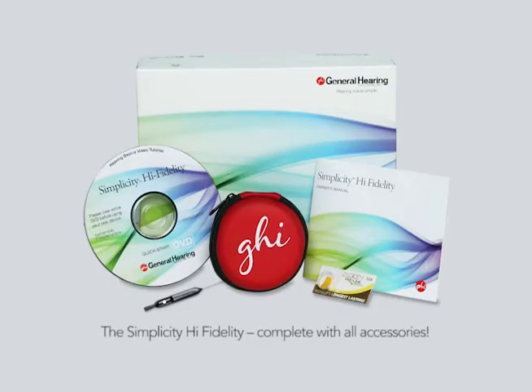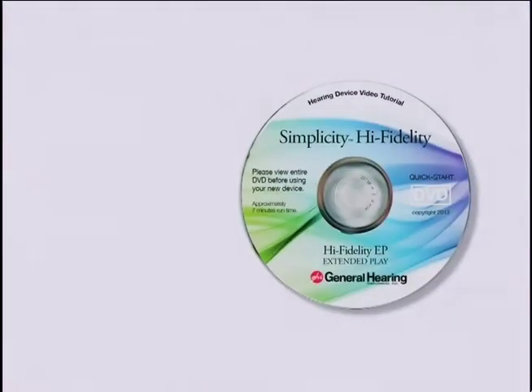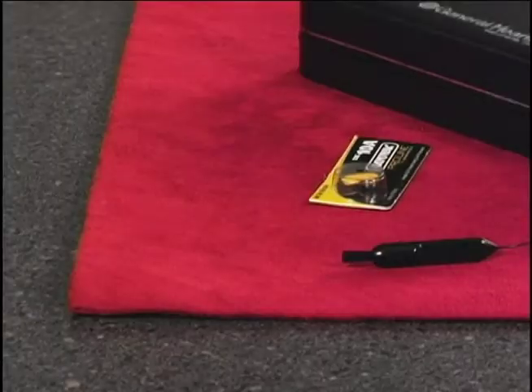Your Simplicity accessory kit comes with everything necessary for you to start experiencing a new world of hearing right away. A size number 10 zinc air battery for each instrument, the travel pouch, the cleaning tool, an instruction manual, and this quick start video. Now that you're familiar with the Simplicity, let's learn how to use it.